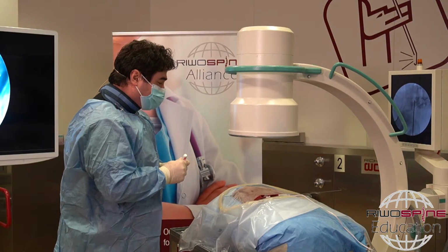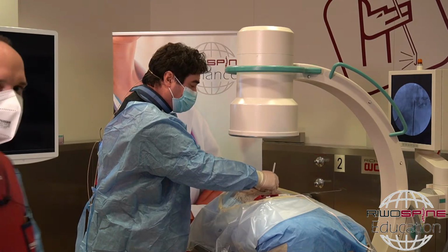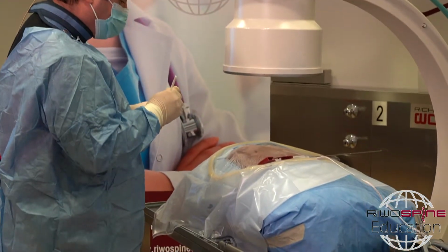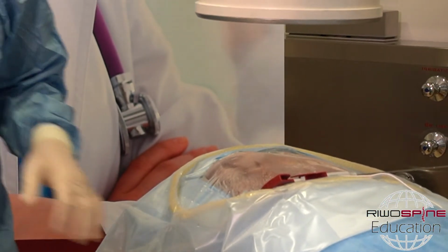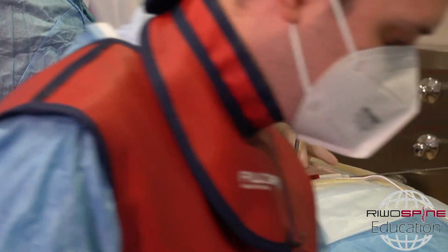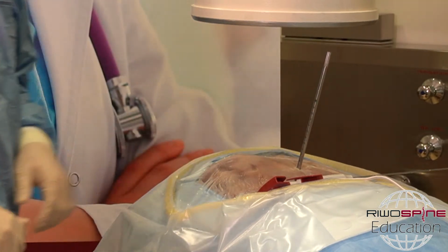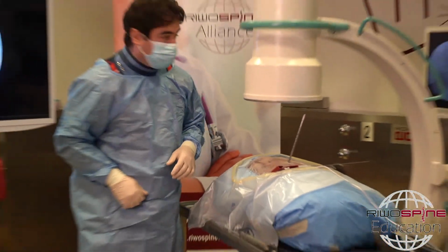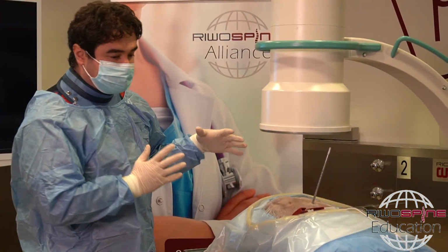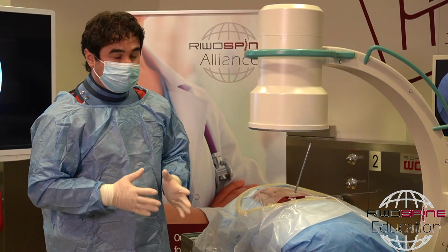Okay, I just marked the skin, and then the next step is the skin incision. Usually the half centimeter skin incision is enough, and the important thing is to cut the fascia also. Directly with the dilator, if you didn't cut the fascia, it's not easy, and I highly recommend you to do it in advance. Then I introduce the dilator straight, and I feel the bone at the lateral side. Which bone? I don't care about it. The lamina, descending facet, caudal lamina, ascending facet. The important thing is not to pass through the flavum ligament.